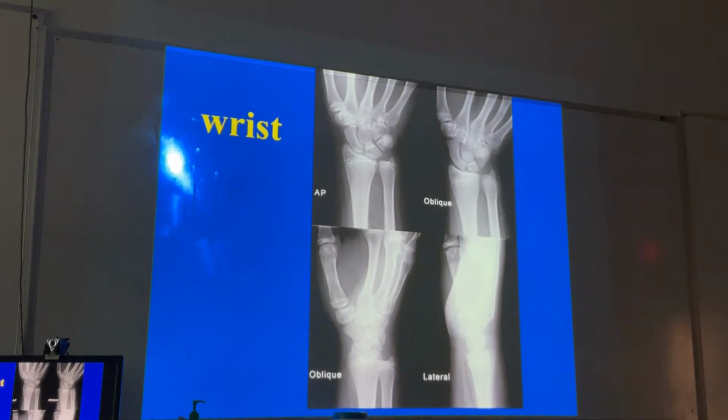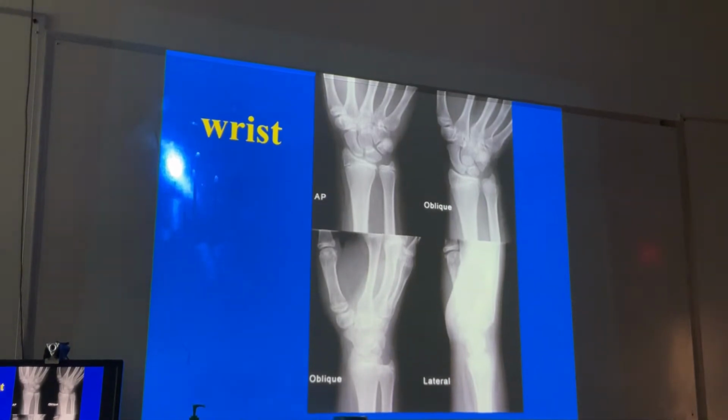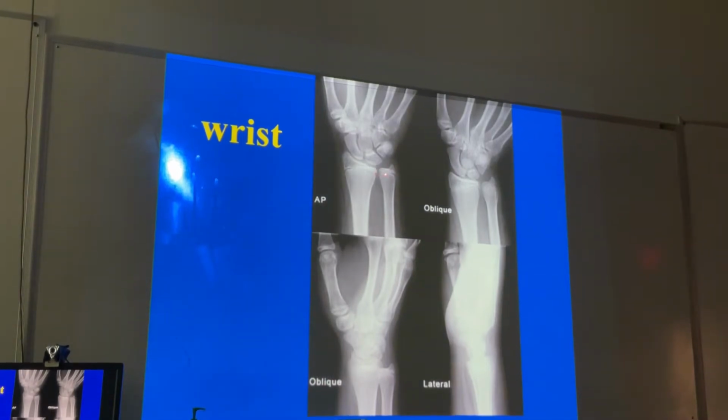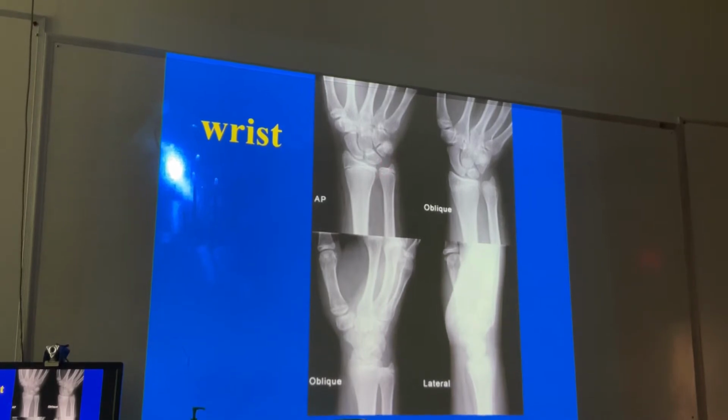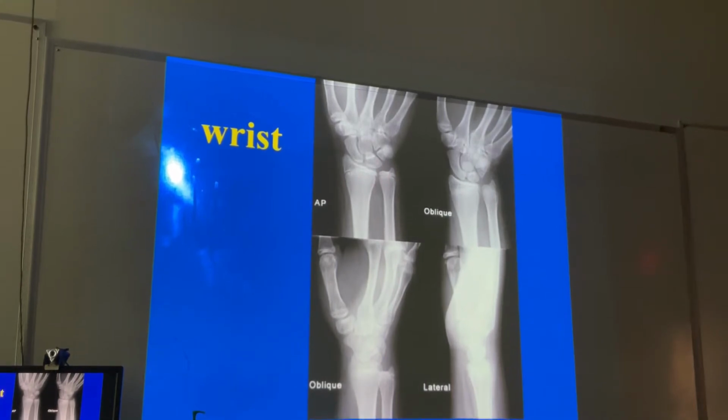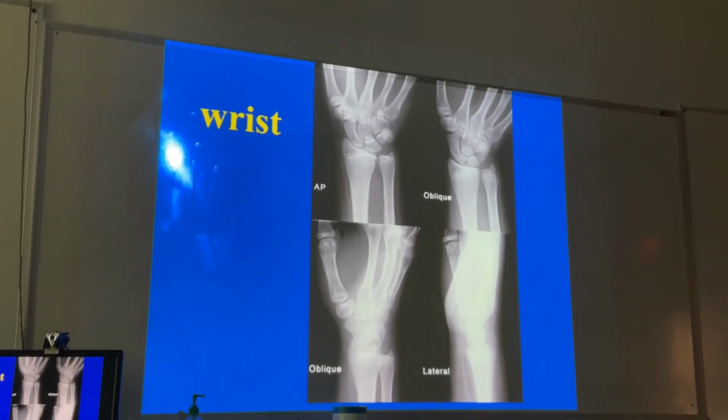Okay? Now notice, it doesn't show as well as I would like it. Generally the ulnar styloid process is half a centimeter shorter than the radius at the distal radioulnar joint. That's the normal relationship. If it's dramatically shorter, that's called negative ulnar variance. And if it's dramatically distal to it, that's called positive ulnar variance. What does that mean? That means that you have disrupted the ligamentous holding elements and you've got a floppy intercarpal joint. All right, so it's always based on normal.